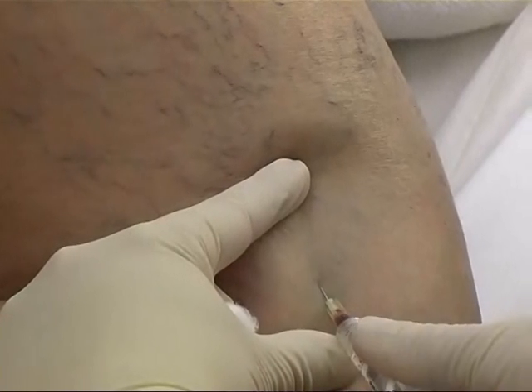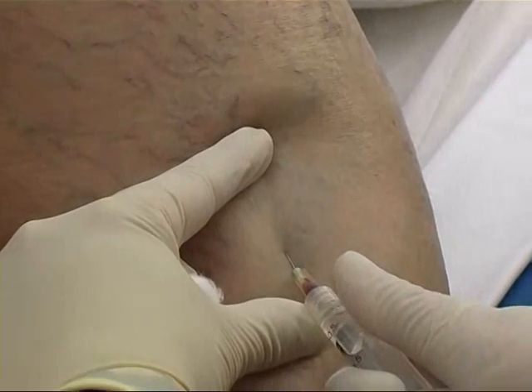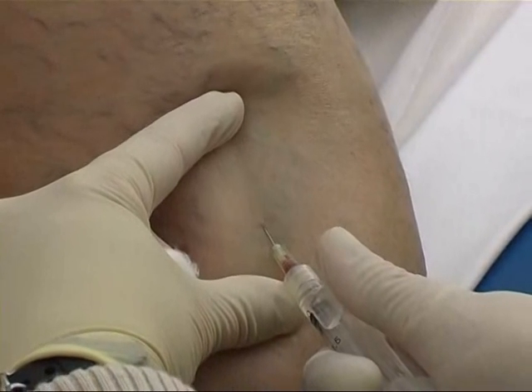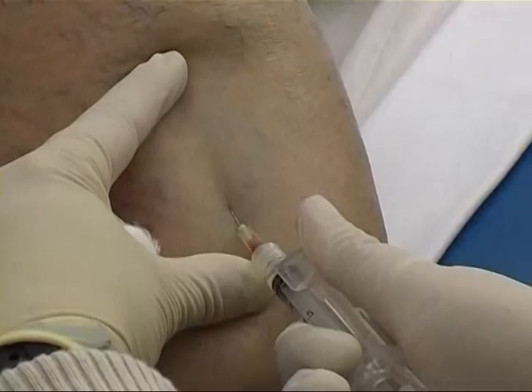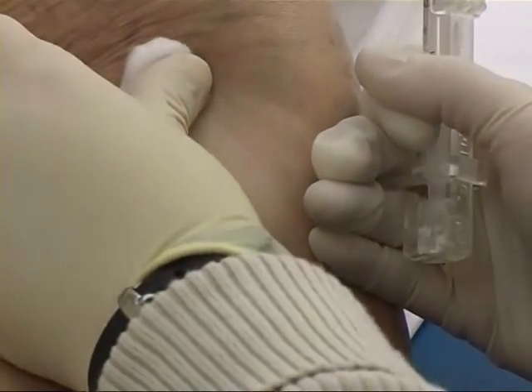Again, reticular varices are injected before the telangiectases are attempted. This sclerotherapist stretches the skin with her left hand and empties the veins as the fluid is injected.